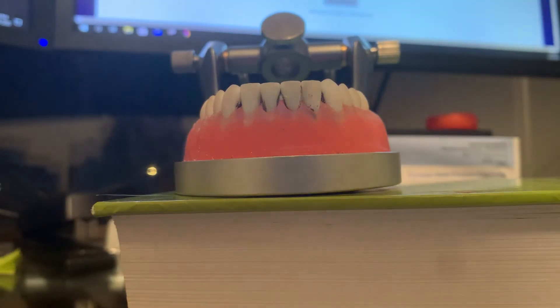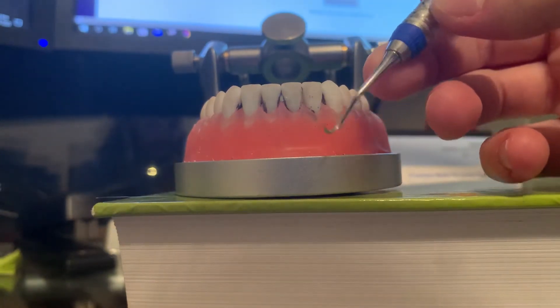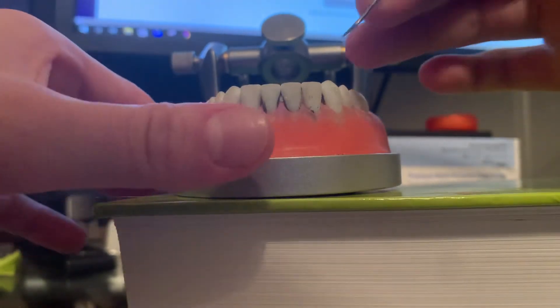This is my instrumentation video for the Nevi 1. The Nevi 1 is a straight shank. It is used on anterior teeth and it is a sickle.